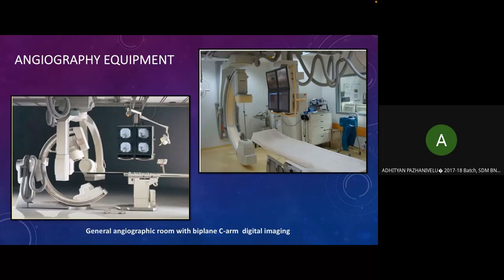Yeah, this is a picture of the equipment that is there. This is a C-arm because it looks like a C. Here we have the X-ray emitter, and here we have a sensor, and the patient is usually sleeping like this, and wherever the part you want, this will move. This can also rotate like this to become horizontal. Okay, here they have the screens. This is for the lights for the surgeon, and on the screen they visualize what is happening.